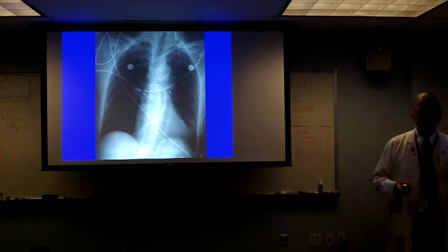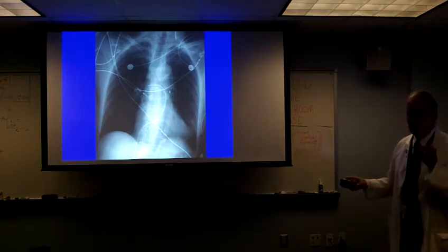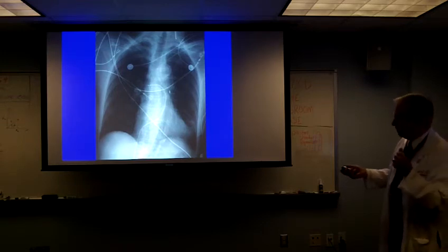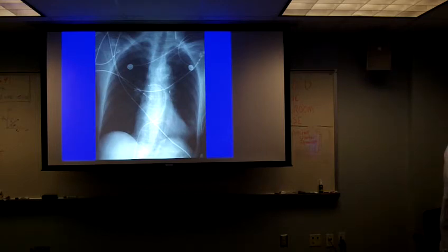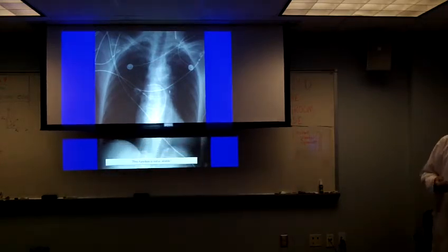Most of the time it's spent, I take that back. It's inflated for the longer period of time, but it can be instantly deflated with appropriate signals on your electrocardiogram. And the idea of this thing is to increase coronary perfusion. And I'm going to have to do a little board work here to explain this to you.